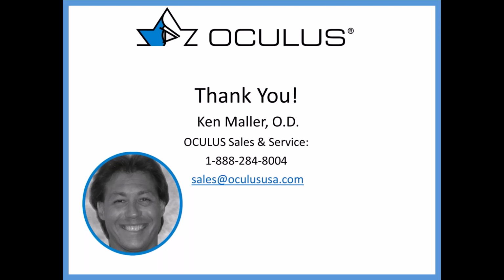And then, although I haven't done it much, I've done a little bit with it. Once I get a lens on there, I'll take the aberrometry scan once again with the lens-eye combination to see how that's been reduced. The next step, logically, will be to take that measurement and add it into the actual lens design, have that lens incorporate those optics and go ahead and improve the quality of the vision even further. And that absolutely is going to be in the very, very near future.